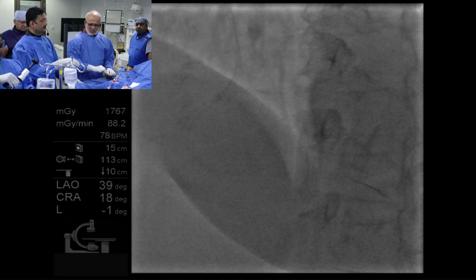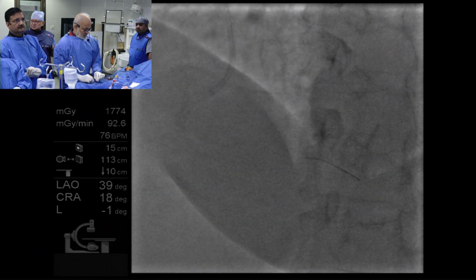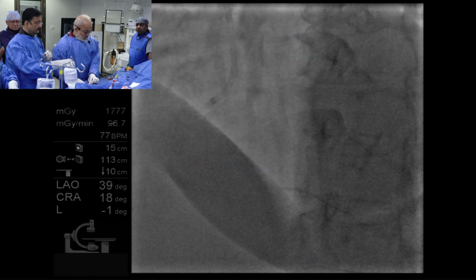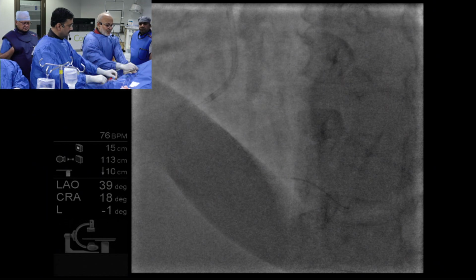We are going very slow and step by step. I hope it is okay with the audience as well as the panel. It's a perfect pacing because it's time for consideration, discussion, ask all these little tricks. It's really great pace. So please keep it the same pace.